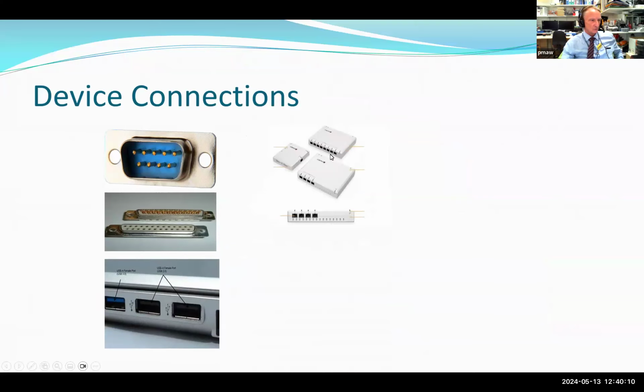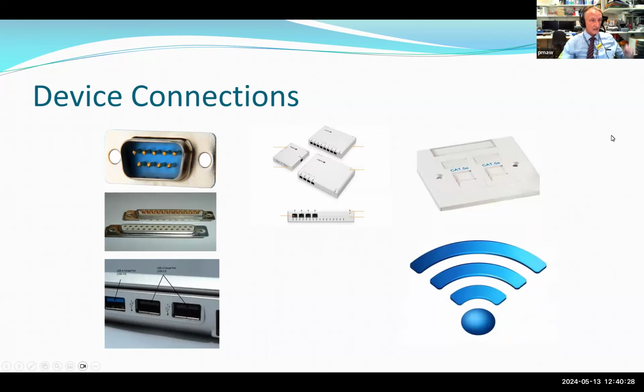These all connected to these data aggregators. So within intensive care, you'd have a bedside monitor and a ventilator connecting into one of these devices. And then that would transfer its information using fixed Cat5 connections. It was capable of Wi-Fi, but our Wi-Fi isn't particularly good, so we didn't use it, but it could do that.